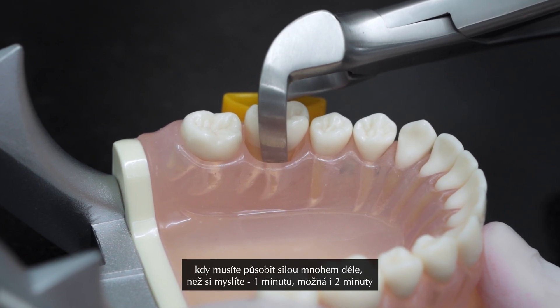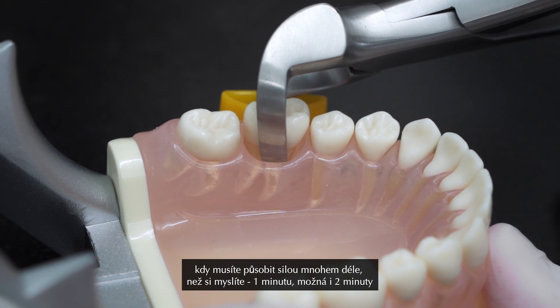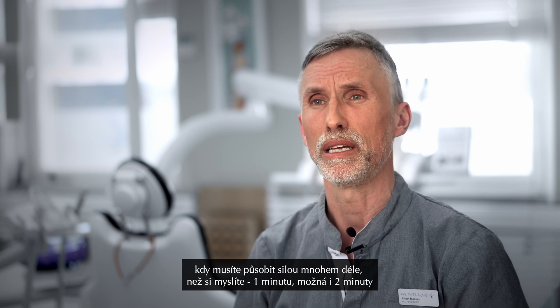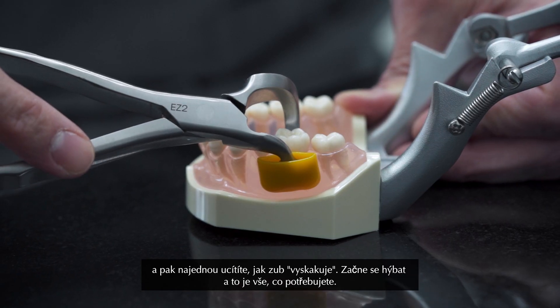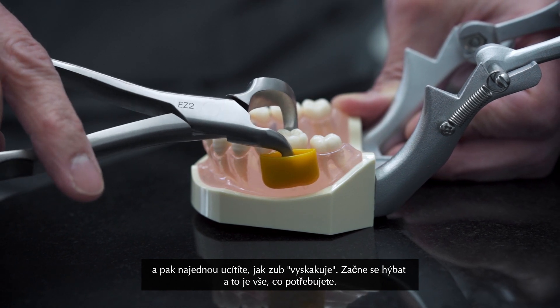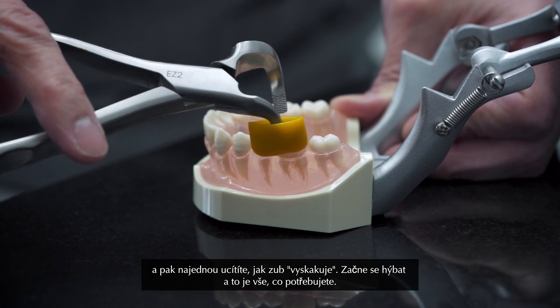Sometimes you have to apply the force for a much longer time than you think — one minute, maybe two minutes — and then all of a sudden you feel the tooth like popping. It starts moving, and that's all you need.